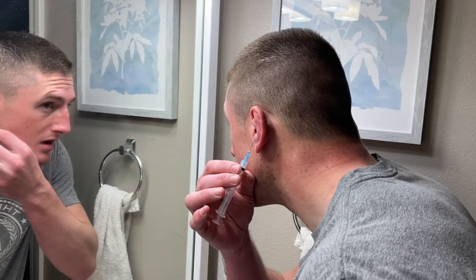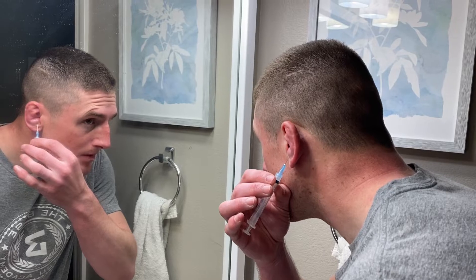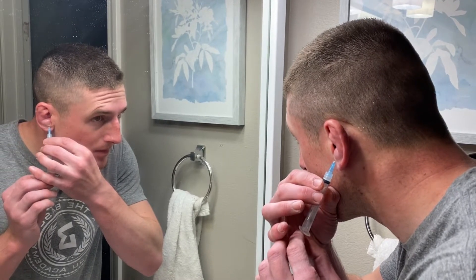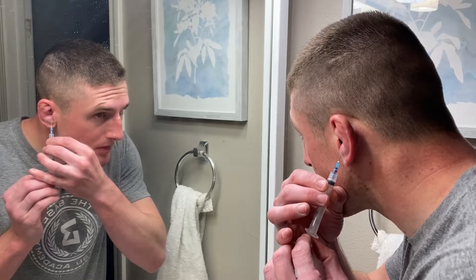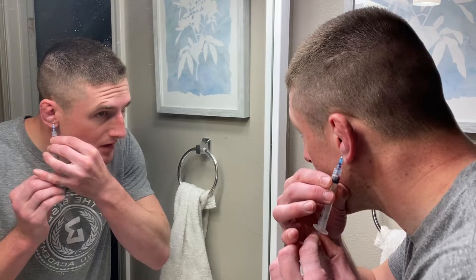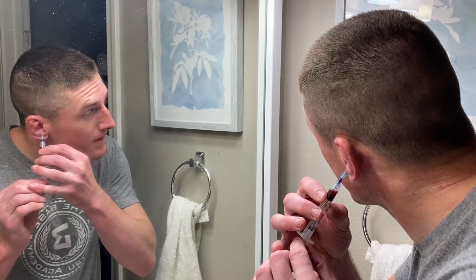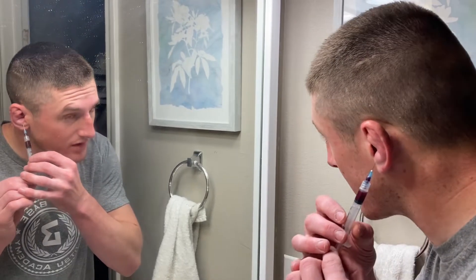Coming in from the side — sometimes you got to find the pocket. Pull a decent amount out; it'll refill, but this is kind of helping it not completely close. My blood is already starting to thicken because it's been like this for a little bit.